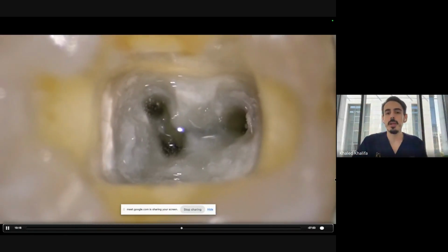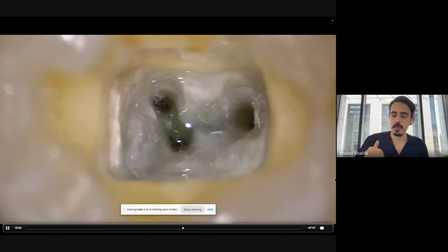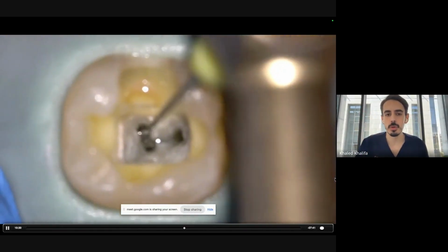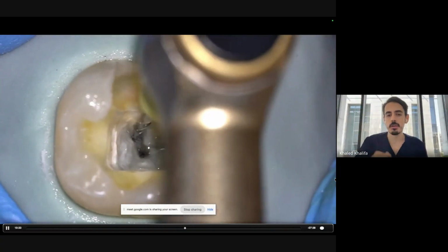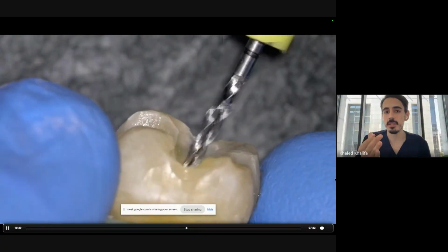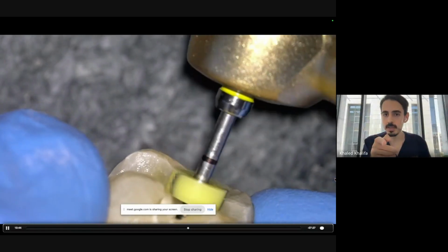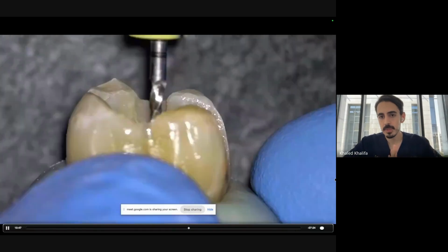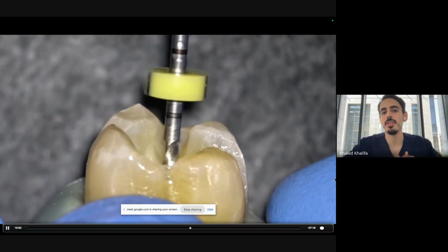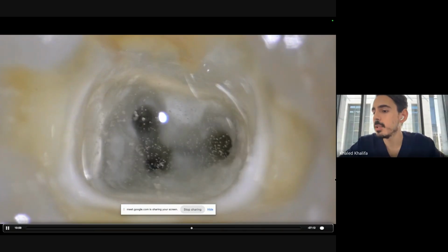After doing a reproducible glide path, SSGP or ATR inside the canal, and as we said, high speed, 500, and minimal torque, it's time to do the shaping now, using a 20 taper 4, okay? On ATR, adaptive torque reverse. So the file now is proceeding on rotation. When it reaches resistance, look, it's gonna turn into a reciprocation motion. Look, it's reaching reciprocation motion. Can you see now? There you go. Rotation, and when it reaches resistance or anything, it turns into reciprocation motion.